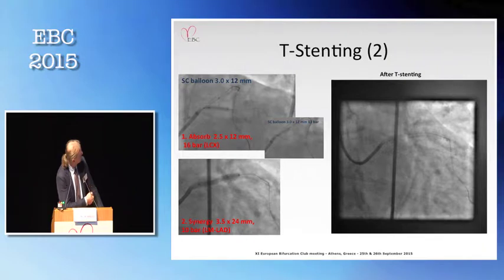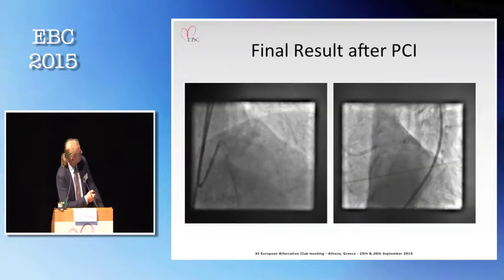And then we put a Synergy stent, as you see here, from left main to LAD, then rewiring back to the circumflex, and of course finalizing with two non-compliant balloons, with the kissing balloon technique, and finally we usually use POT for this left main, because this is not 3.5 or 4, but usually 4.5 or something like that.